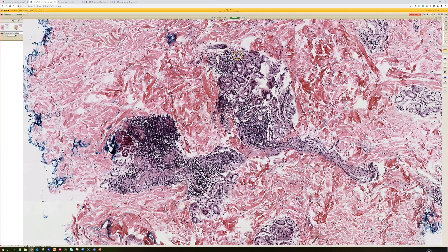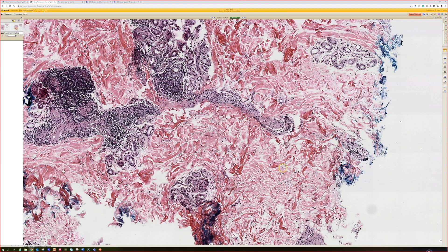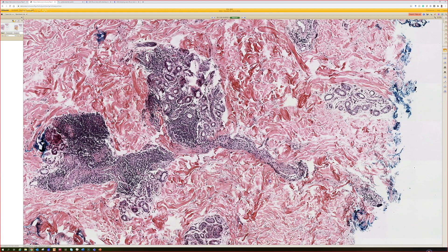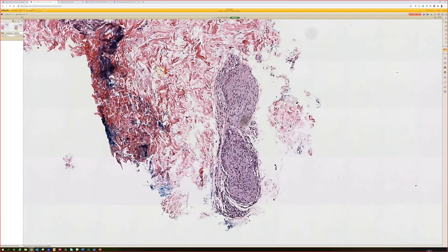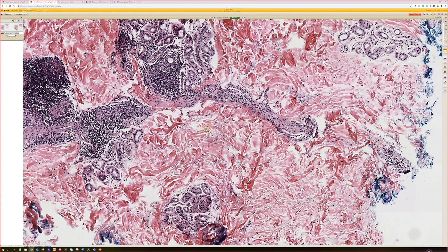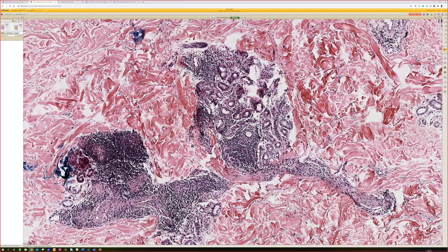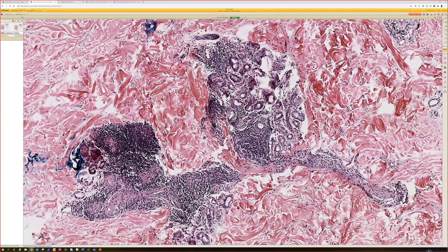This is kind of hard because right here it's all lymphocytes. Whenever I think perineural, in the section we're in, I would think of leprosy, but that would be more histiocytic. With the lymphocytes, I'm in my superficial and deep differential, which could include lupus, Lyme — which would be infectious — and also syphilis because it's a great mimicker.